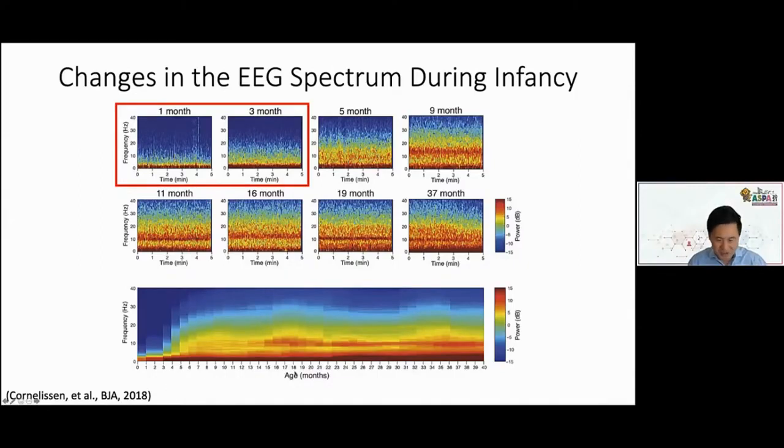Here's a continuous kind of plot of the spectrum. Earlier I showed you the coherence, which isn't available on any of the present day monitors, but the spectrum, the power you do see, and again, here you go, you can see that transition starting somewhere between 4 and 6 months of age. So as soon as you see that, you can use those higher frequencies to titrate. But yeah, what do we do about the younger kids?